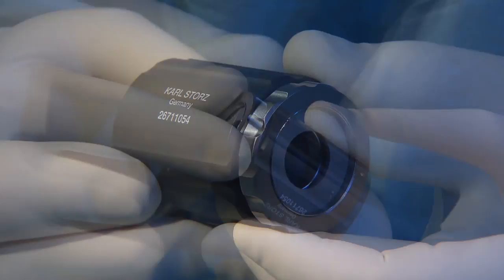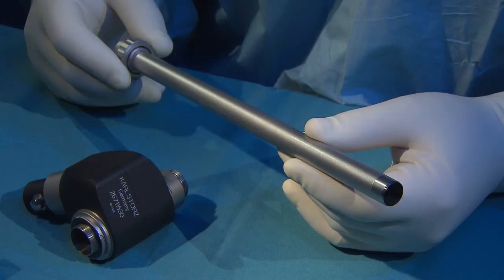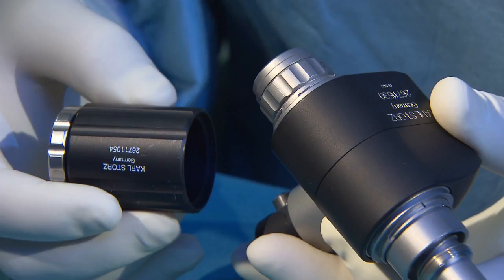The extraction knife is pushed through the motor section, which is protected by two housing shells, and locked in place with a left turn. The sealing cap is then screwed on.